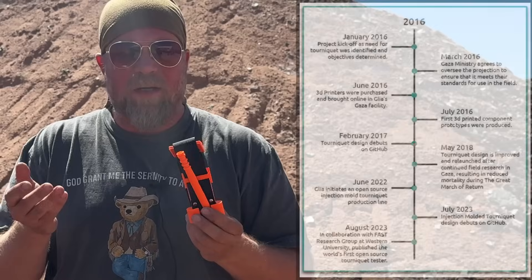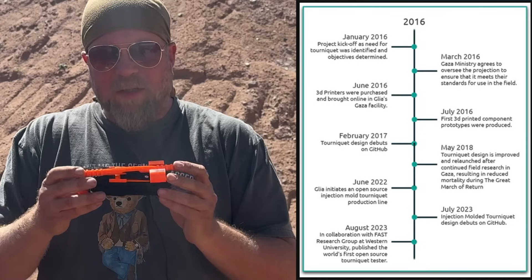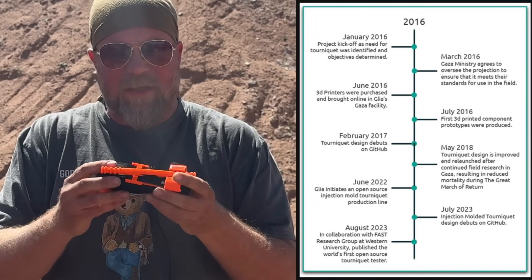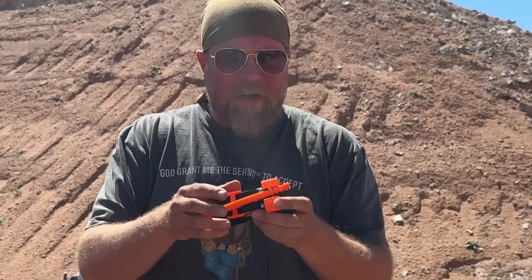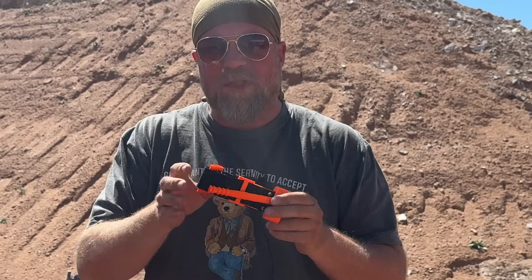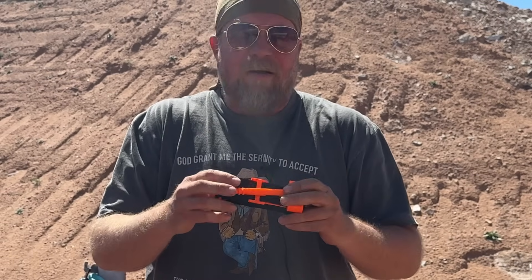It was developed in 2017 and put into mass production in 2018 in Gaza, and there are some modifications to it. It looks like a traditional CAT tourniquet, but it's actually not. One modification is specifically designed to allow it to be applied to smaller diameter limbs, because a lot of modern professional tourniquets don't work on smaller limbs such as children or even animals — and 50% or more of casualties in Gaza are children or animals.